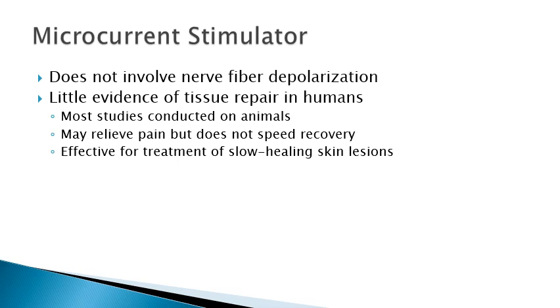Here's all I really want you to know as far as microcurrent is concerned. If you were going to use it for healing, you want to be between 20 and 60 microamps for the intensity, and about 0.3 hertz for the frequency. For pain control, you're just going to increase the intensity and use a higher frequency.